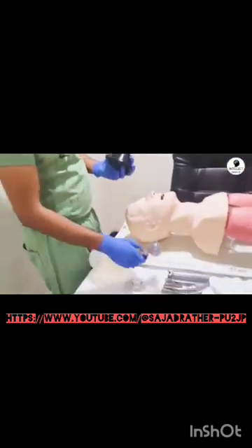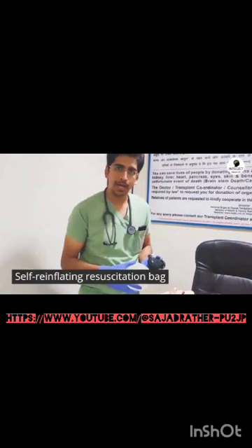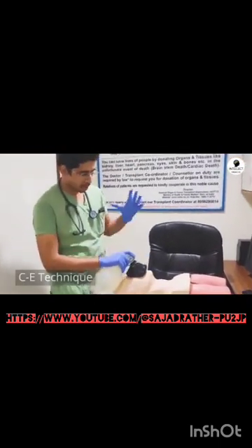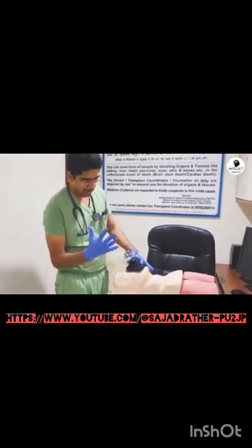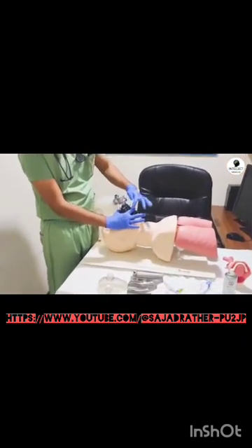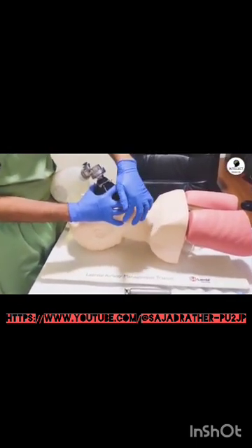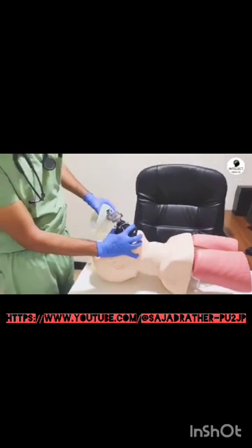Now, as I already said, this is a bag. This is called a self-reinflating resuscitation bag, also called an Ambu bag. Now, attaching it, you need to hold the mask with the C and E technique. Although I prefer to use my left hand, just to show you, I will show with my right hand. The thumb and the index finger should be like a C, standing for compression of the mask onto the face of the patient, and these 3 fingers should make an E so as to elevate the jaw. And then with the other hand, you have to inflate.